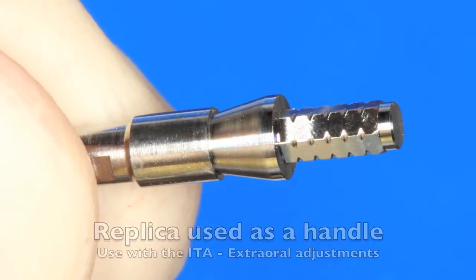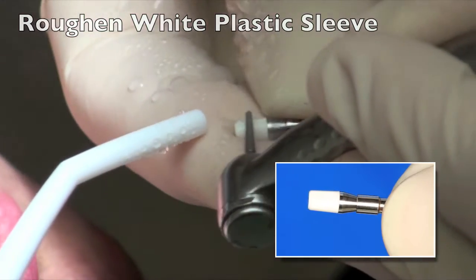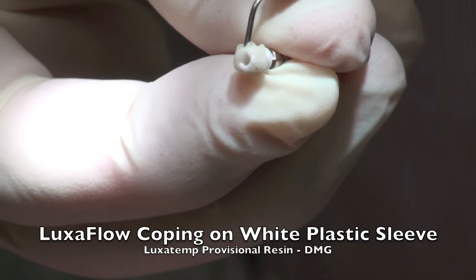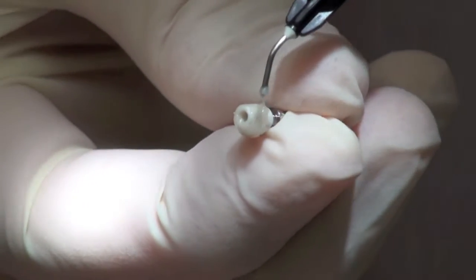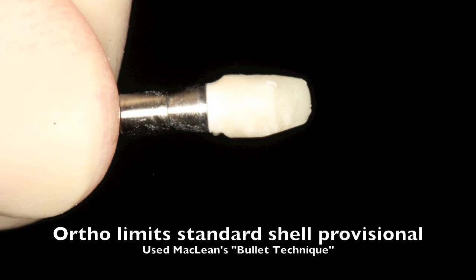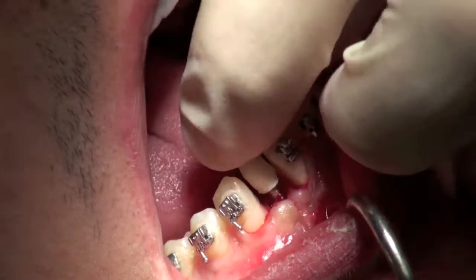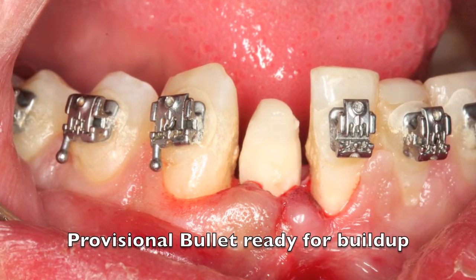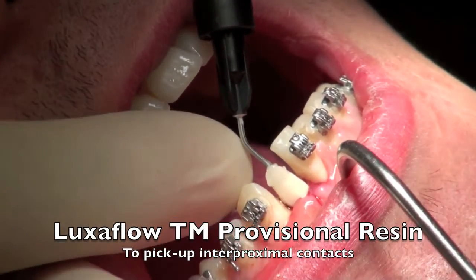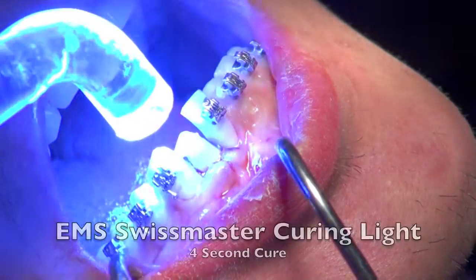One of the things I like to do is take a replica and use it as a handle. I'll make an immediate temporary abutment attached to the handle and then start to create the temporary. One of my goals is to have no flowable free resin in the sulcus at the time of surgery, so I start to add some of the resin on the abutment sleeve prior to going to the mouth, creating a little bullet — I call this the bullet technique. Once I get the bullet with a little bit of resin, I can take it to the mouth and pick up the rest of the aspects of the temporary intraorally without any free resin in the sulcus at all. This takes me about eight minutes to create.